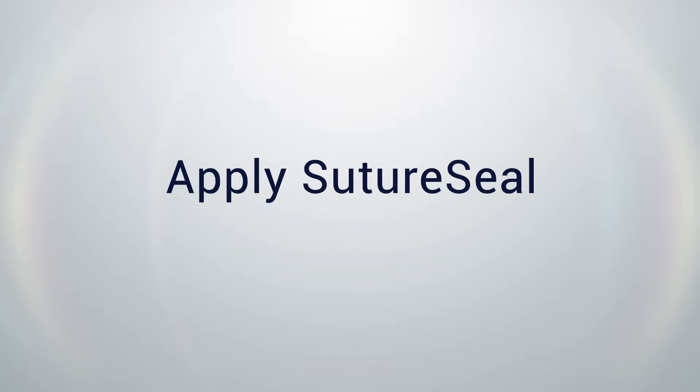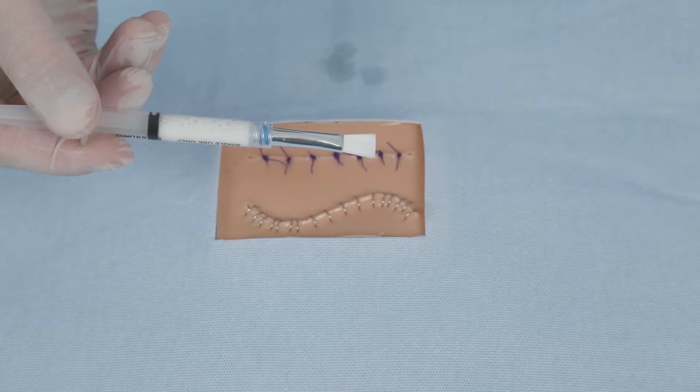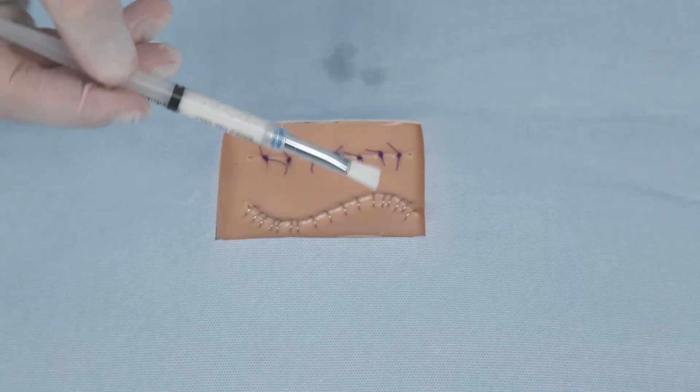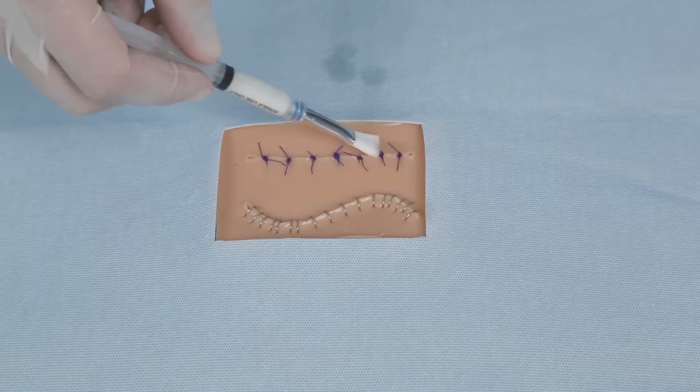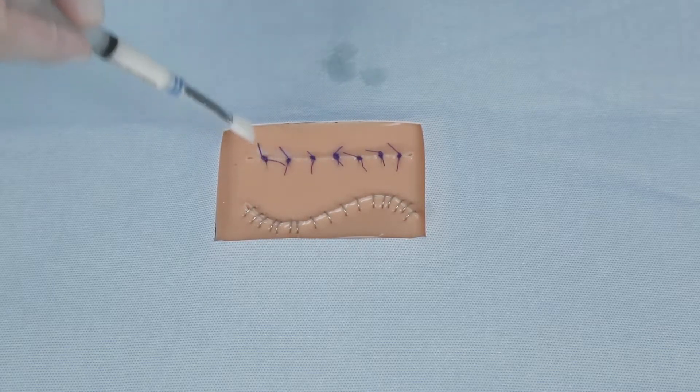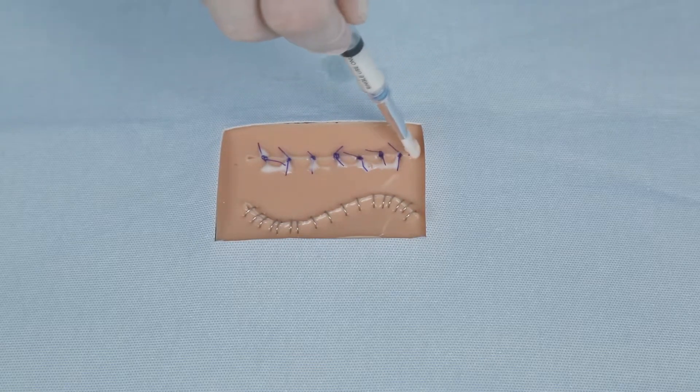The last step is to apply Suture Seal to the affected area. Suture Seal can be applied to incisions with sutures or staples and many types of open wounds. It is important to note that after the products are mixed, you have approximately 80 to 120 seconds to apply Suture Seal to the incision or wound before it gels into a clear flexible sealant.